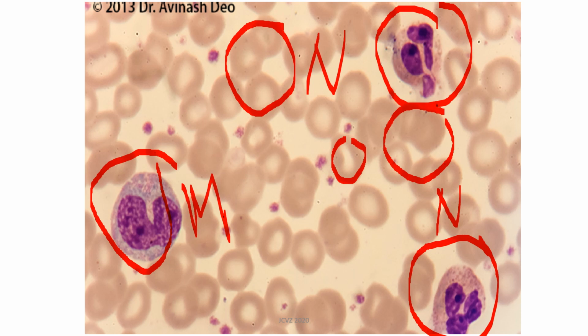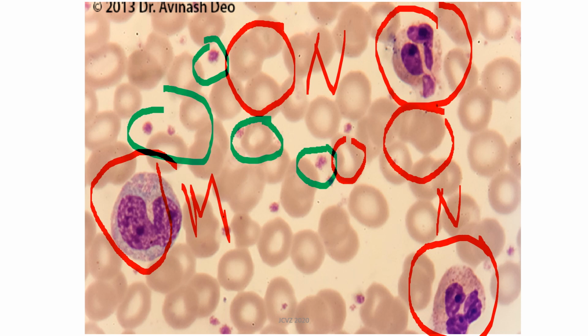And for the platelet estimate, the most important thing here are your platelets. Okay, these are your platelets. They don't really look like dust or microorganisms. They're just so small actually that you sometimes identify them as dust or dirt or artifact or microorganisms. But these are platelets. Okay, they're quite bigger as compared to what we have viewed earlier under the high power objective. Okay, so these are your platelets.